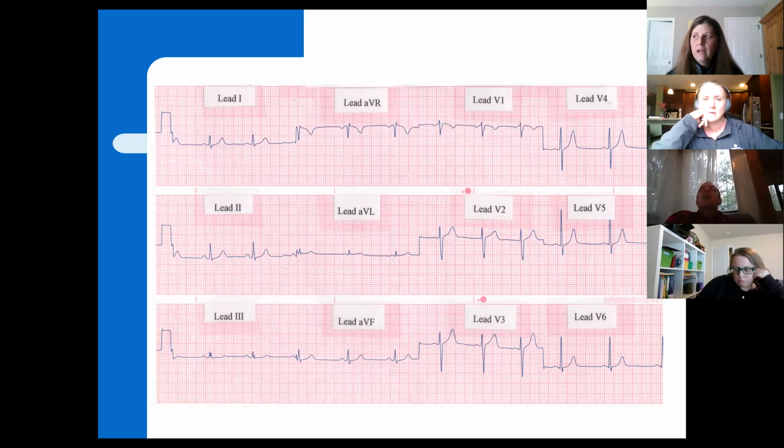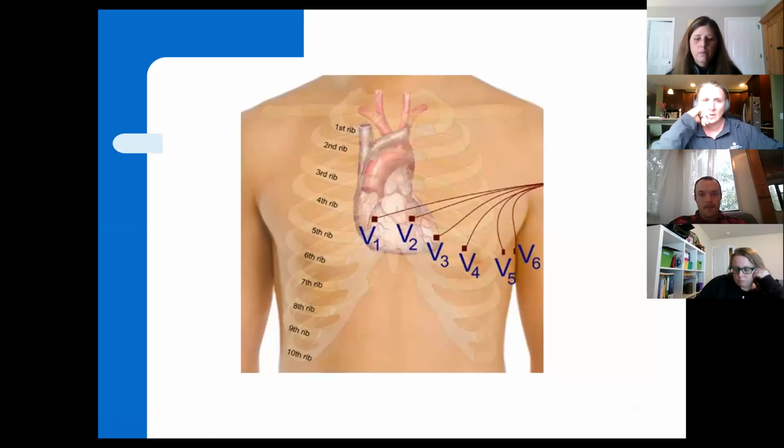And we're going to talk about that as we start talking about what steps are. Dr. Benetti mentioned that this morning. But you've got to have the 12-lead EKG to make a lot of diagnoses. Okay. Again, just another vantage point of what it might look like with the anatomical markings there from the ribs and the heart where you're placing these leads. Okay.